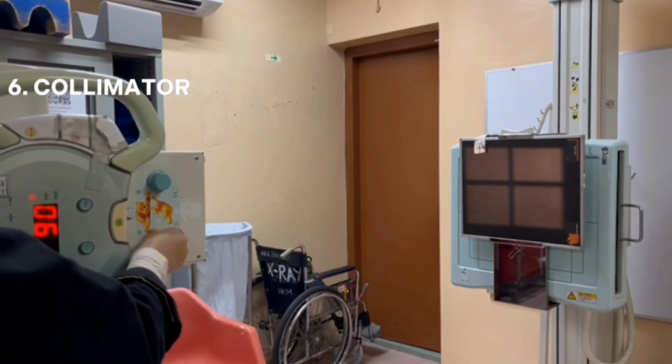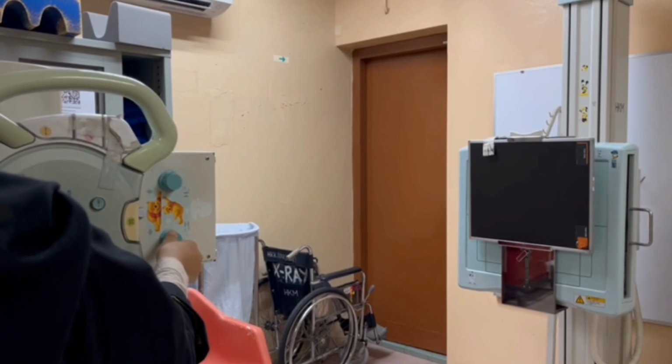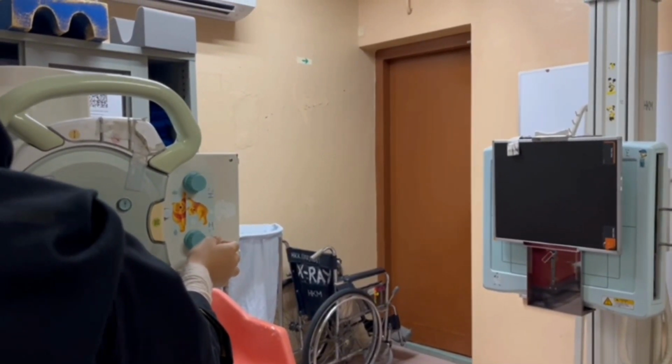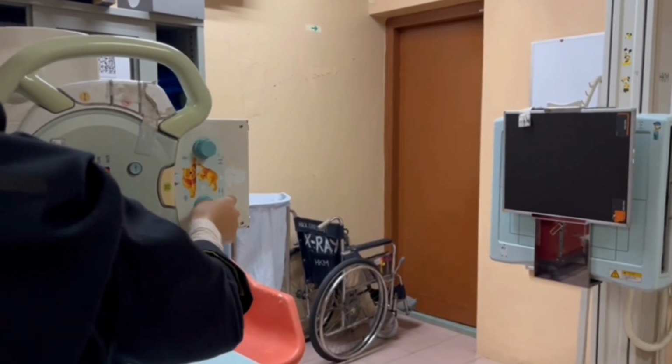So this is the collimator. The function of the collimator is to regulate the X-ray beam size and form. It is to minimize needless radiation exposure so that the operator can make sure the beam is focused solely on the area of interest by adjusting the shutter.